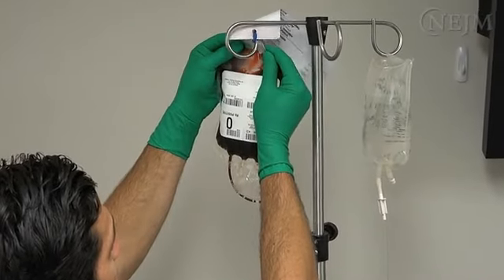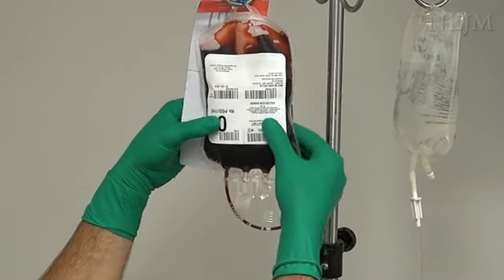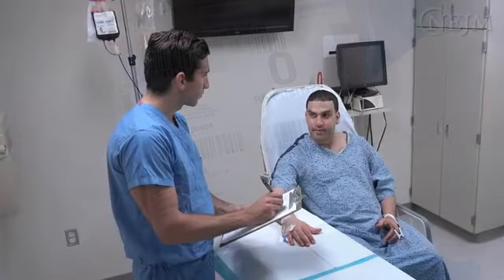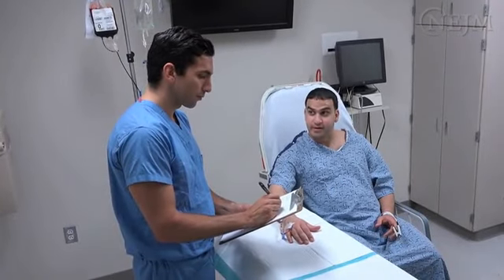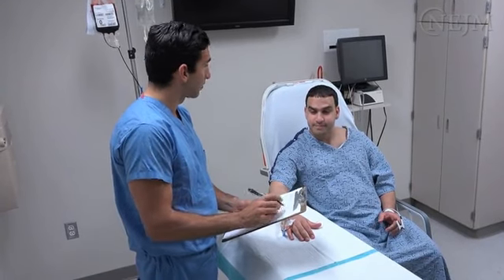This video demonstrates a commonly used method for performing a non-emergency transfusion of red cells, also referred to as RBCs or packed red cells, in an awake, competent adult. The transfusion of other blood products, such as plasma and platelets, is not addressed in this video.